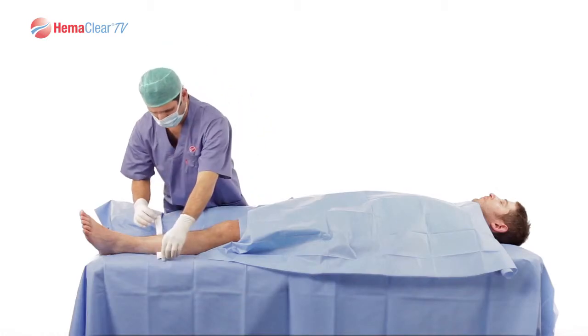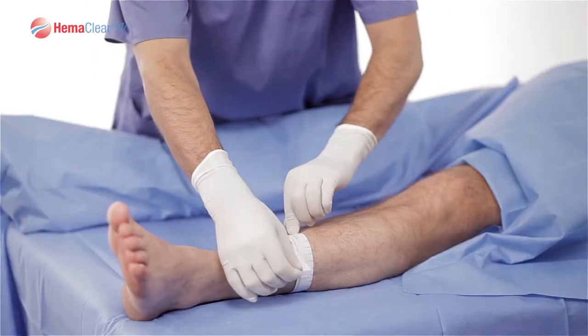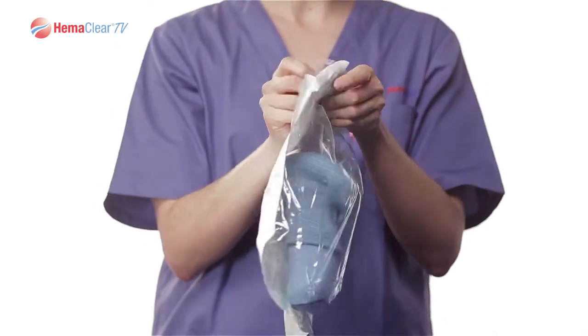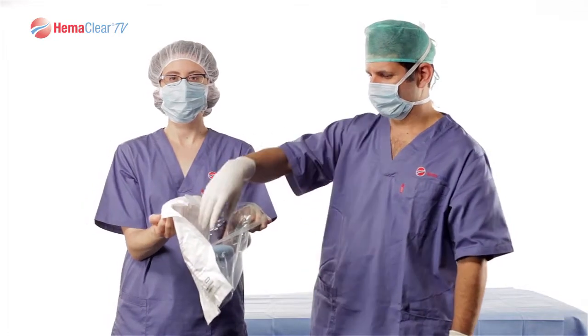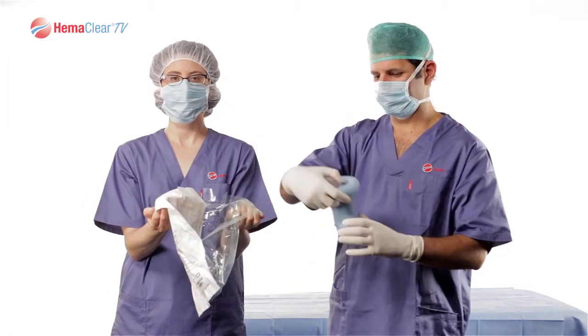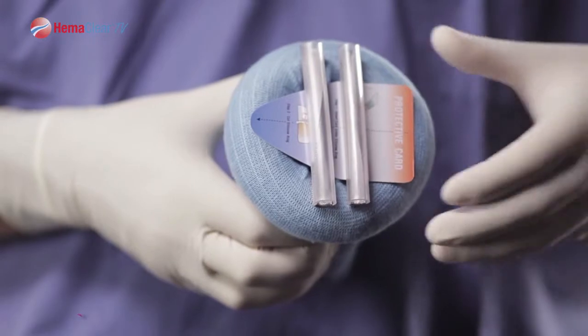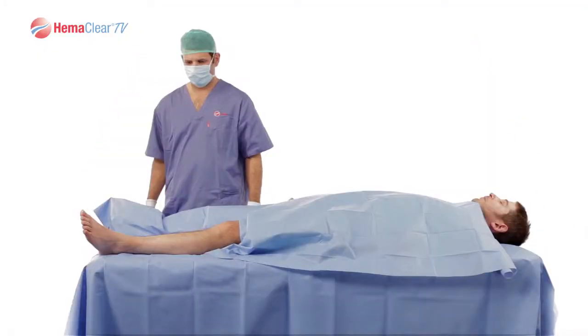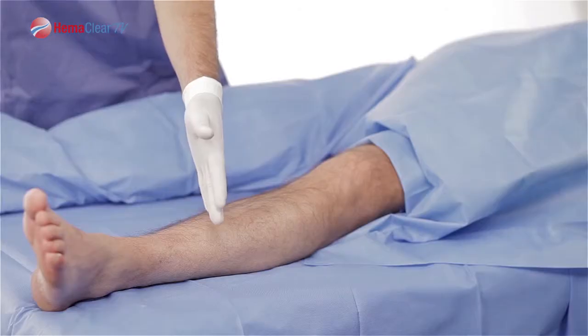Once it has been determined that the patient fits within the Model A size guidelines, open the sterile packaging, introducing the sterile Model A to the surgical field. Note that the packaging is dual-peel packed. Be sure to save the Model A cutting card for the end of the procedure. You are now ready to apply the Model A onto the patient.